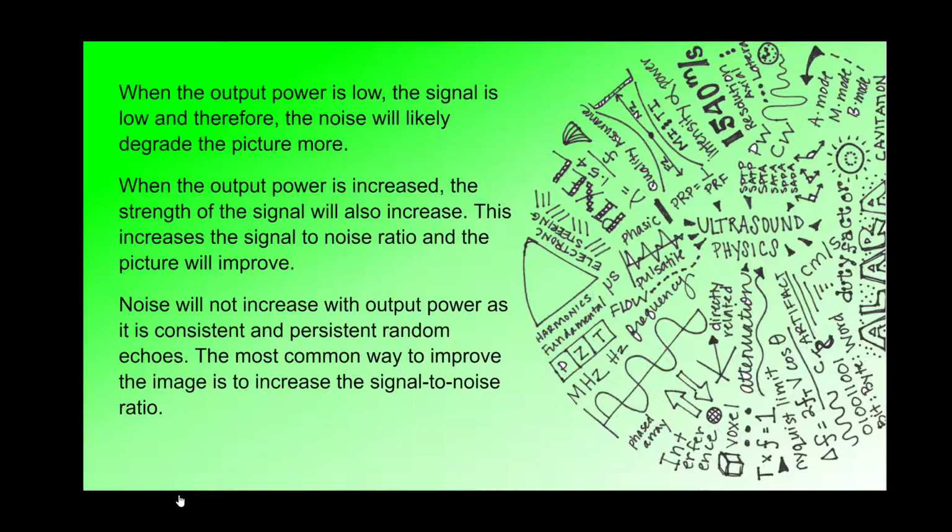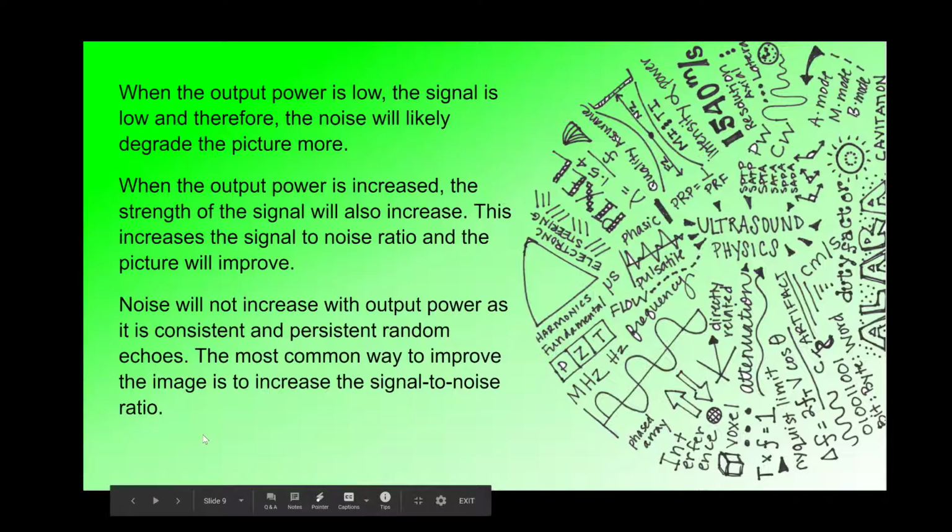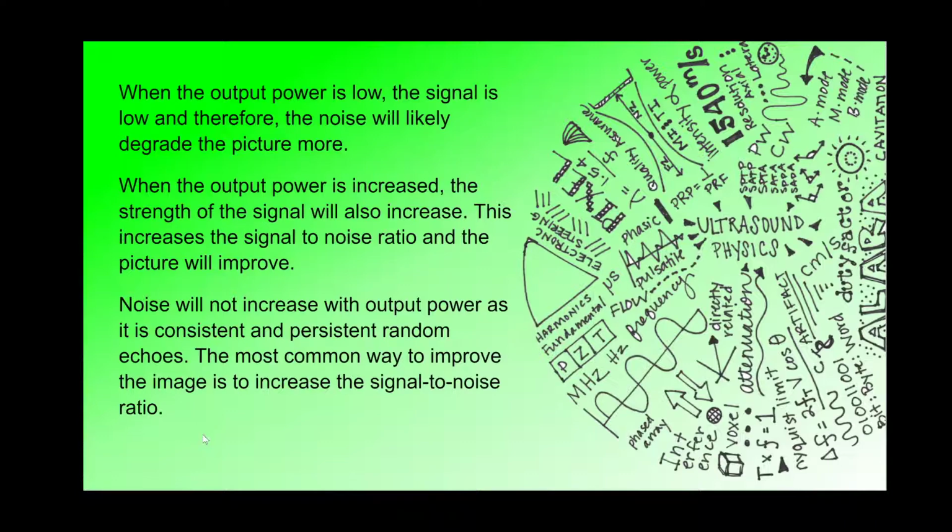The problem is though, that we don't always want that strong power. Again, going back to bioeffects. Are we putting too much ultrasound into the body? So remember that increasing the output power will increase your signal to noise ratio. A high signal to noise ratio improves the quality of your picture.